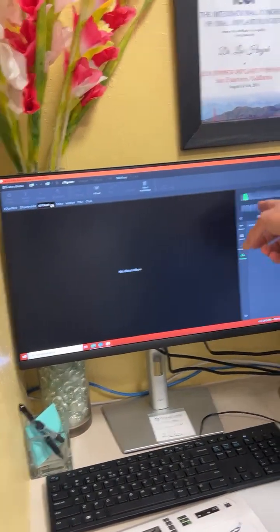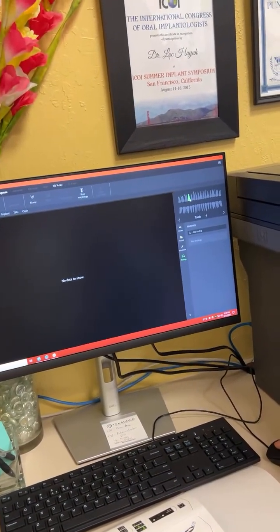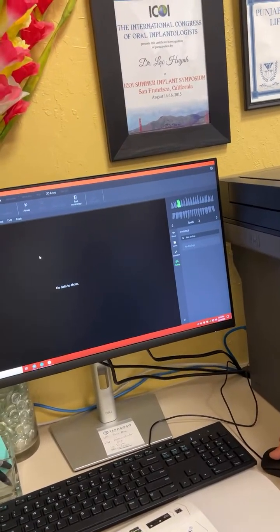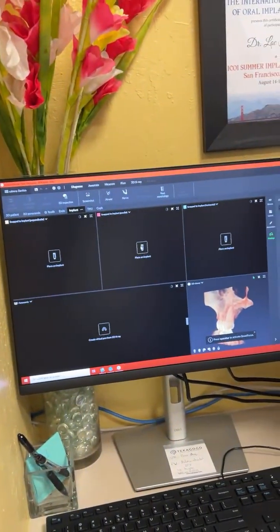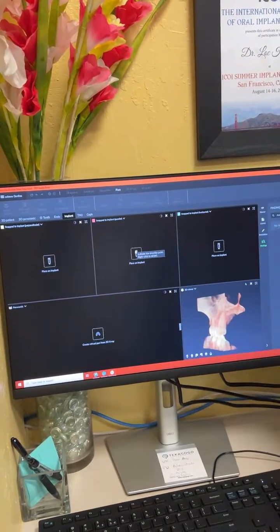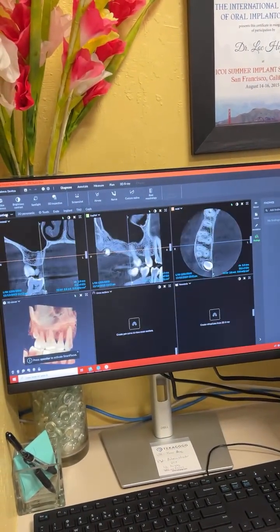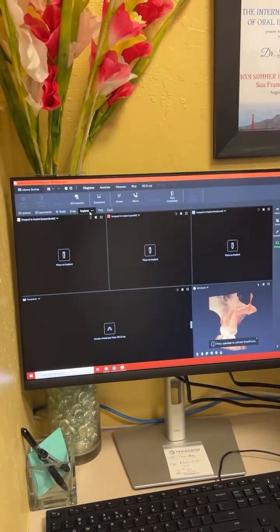Tooth numbers, okay? So now you can click on a tooth and say, I want to see. Oh, I forgot. So let's say we're planning to do an implant on number 3. We're going to take out that tooth. Do the implant. You're going to say place an implant. Wait, so we selected and then we select implant? Can you go back? How do you do it? Okay, and you're going to go to implant. Oh yeah, implant right there.